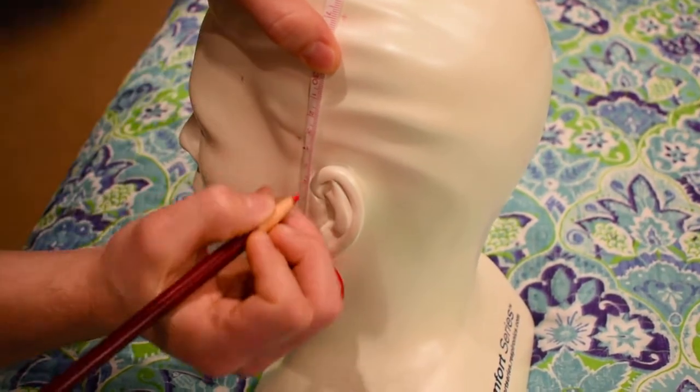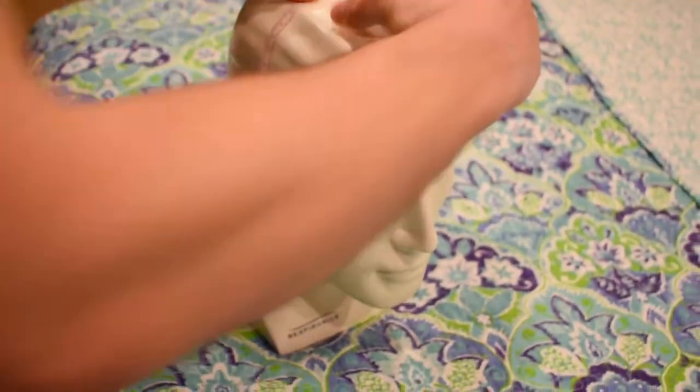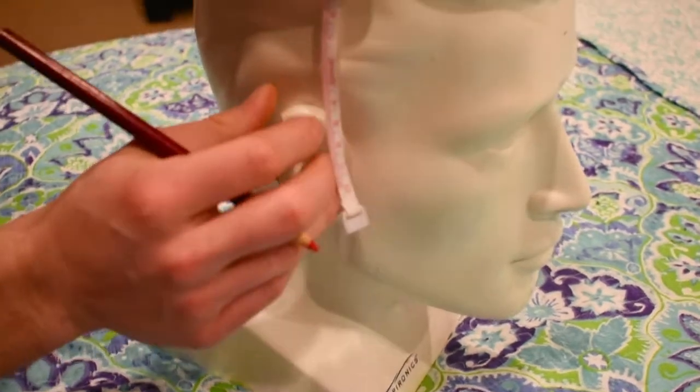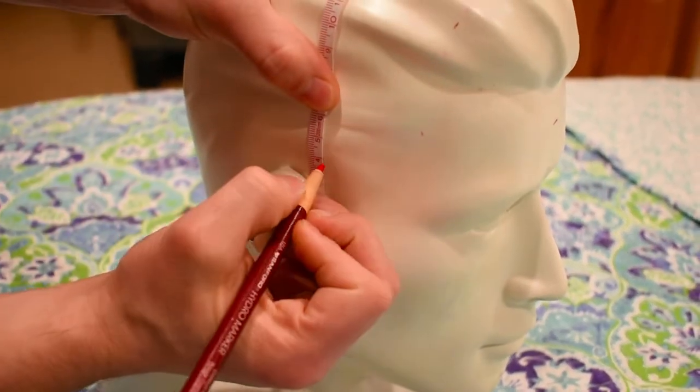Marked right there. And then again on this side, 3.8, which will be about right there.